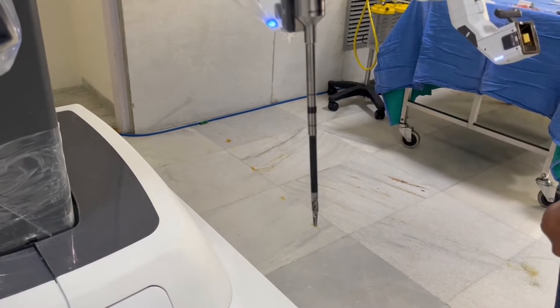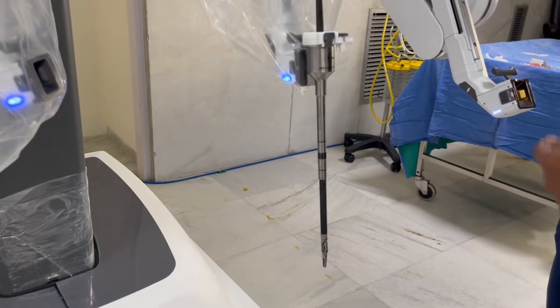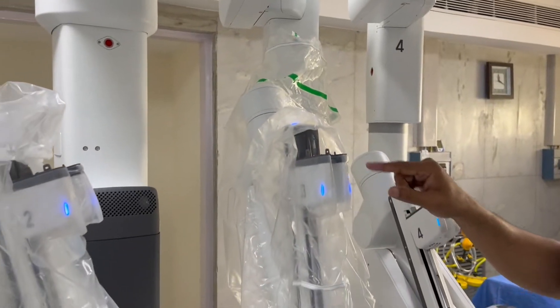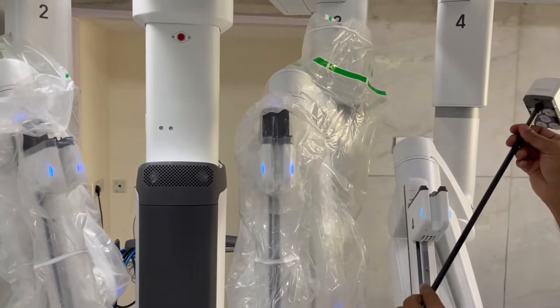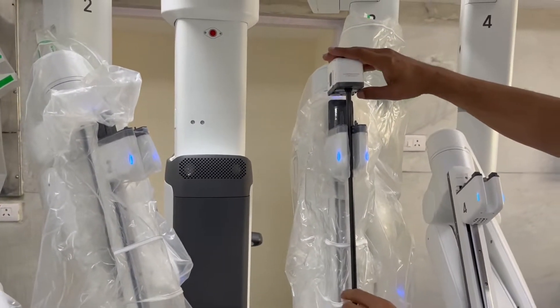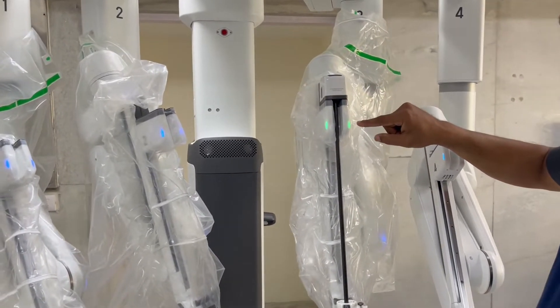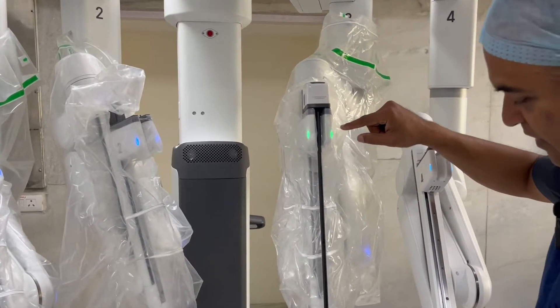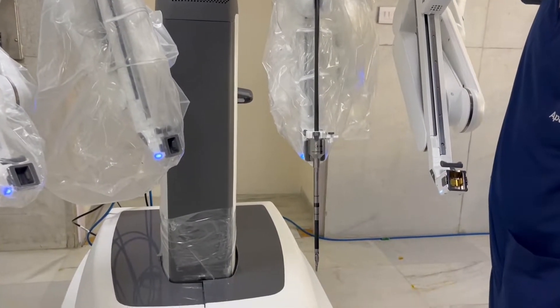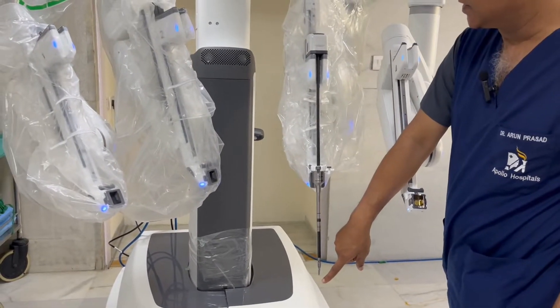When I have to change the instrument, all I do is press this and the instrument comes out. Once the instrument has come out, I can take another instrument, put it inside, and when I put it inside it recognizes the instrument and this starts to flash green. When it is flashing green it means it's ready to be inserted. All I have to do is push this down till the green light becomes blue again. The instrument has gone back to its original position.